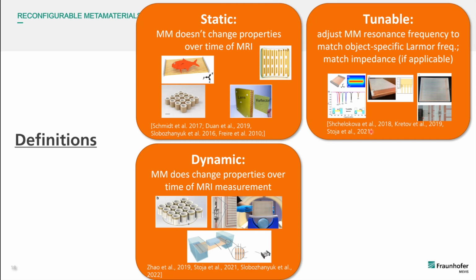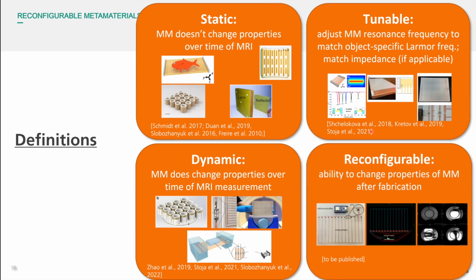And when I'm talking about reconfigurable, I mean that we can change the properties during the imaging acquisition in a very dedicated way.